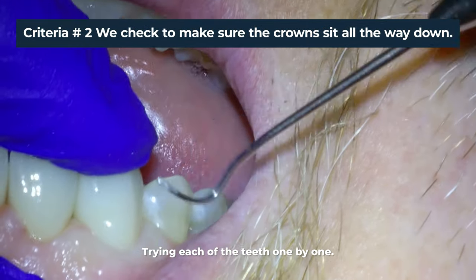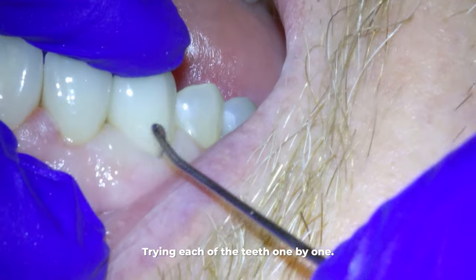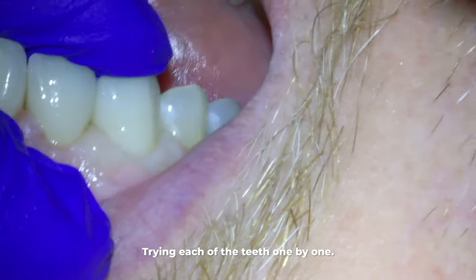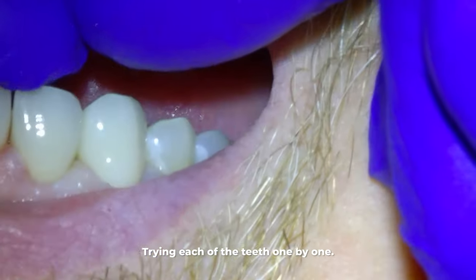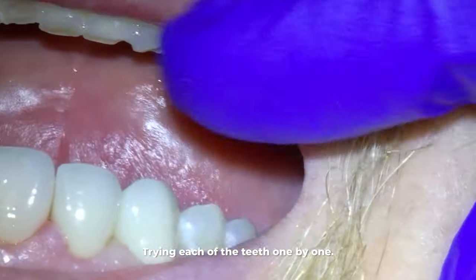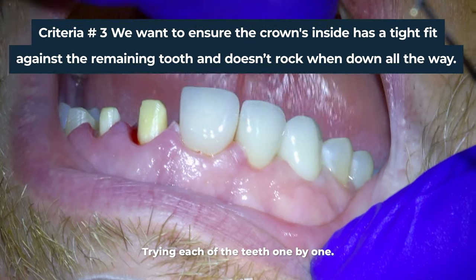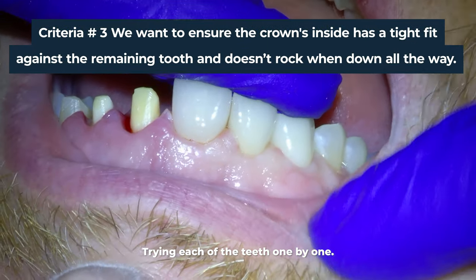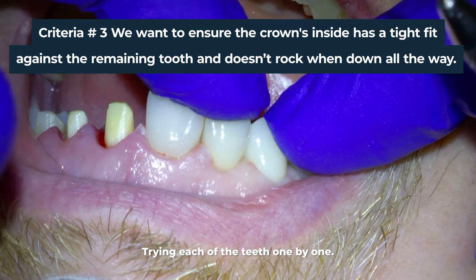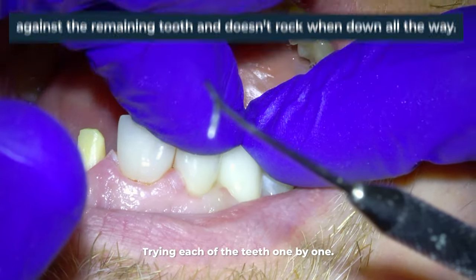Second, you are checking to make sure the crowns sit all the way down onto the margins of the teeth. You want that junction or margin between the tooth and the crown to be seamless so that my instrument called an explorer just flows right over it. Third, you want to make sure the crown's interior has a tight fit against the remaining stump of a tooth and doesn't rock when you put it all the way down.